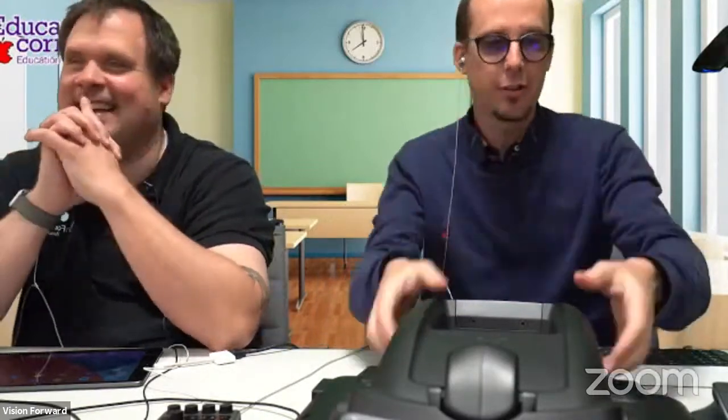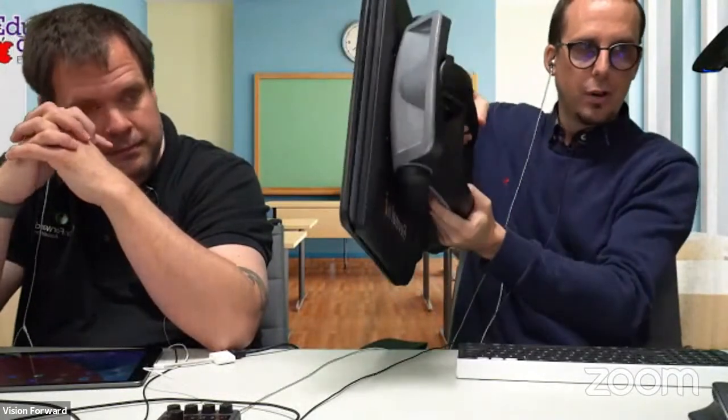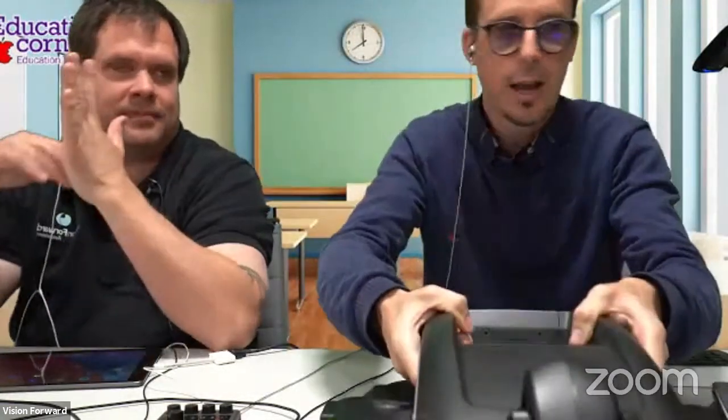The Reveal 16 is a foldable CCTV. That means you can fold it flat and you can transport it. Now, I will say it's significantly heavier than the Connect 12. I had trouble lifting it up. I mean, I'm quite a scrawny guy, right? But I had trouble lifting it up with one hand just then. So you probably don't want to be lugging it around too much, and definitely not for your smaller kids, for sure.